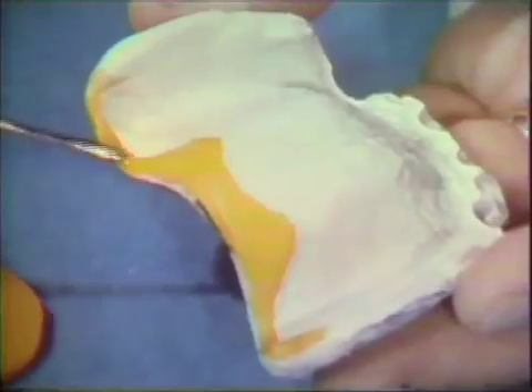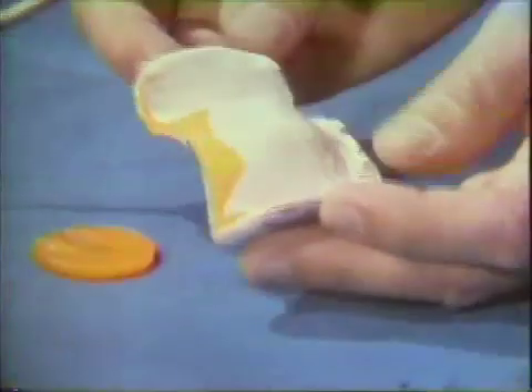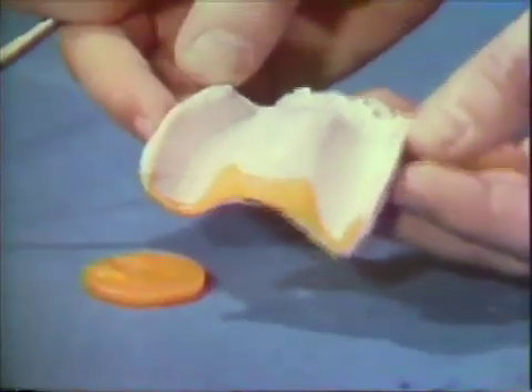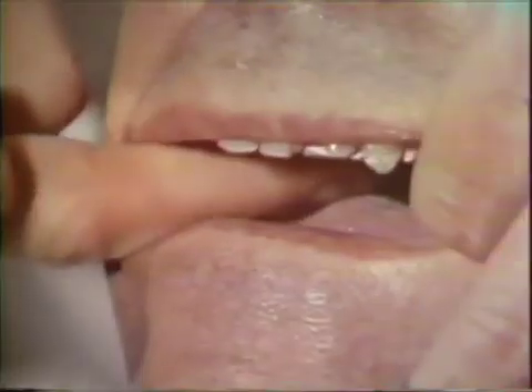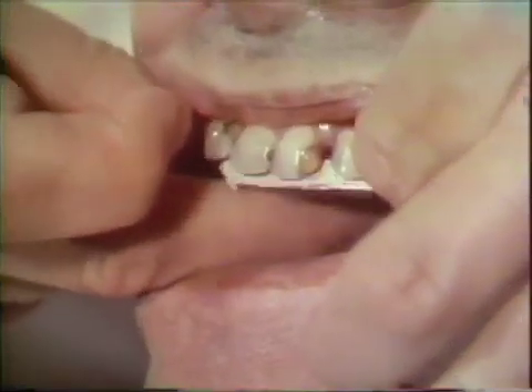A correctable wax which has some flow at body temperatures is added to the posterior border. The wax is placed through the hamular notch areas and made about a quarter of an inch wide at the midline. The posterior impression with the wax addition is returned to the mouth and held in place for about four or five minutes. When the wax reaches body temperature, pressure is exerted on the impression tray. At this stage, the impression should demonstrate good retention. This completes the first section of the impression.